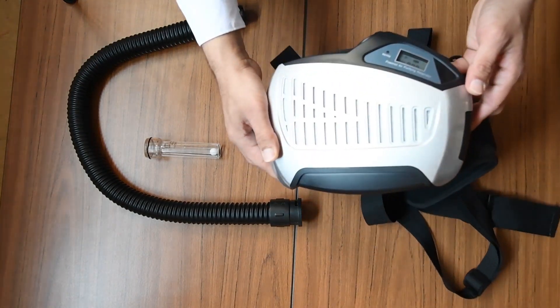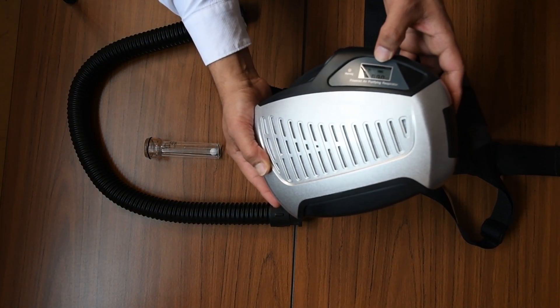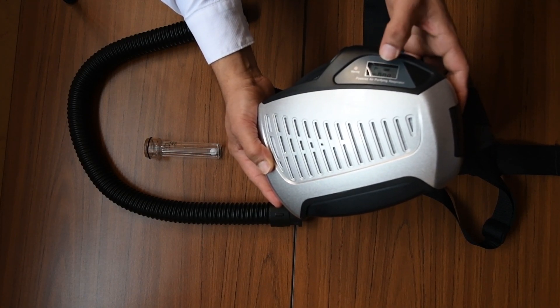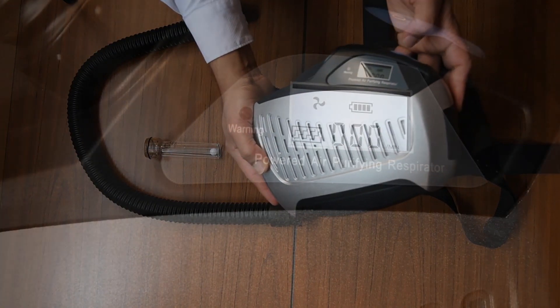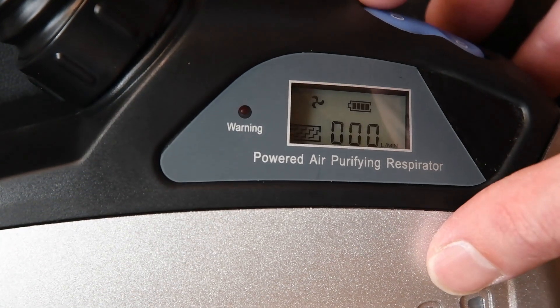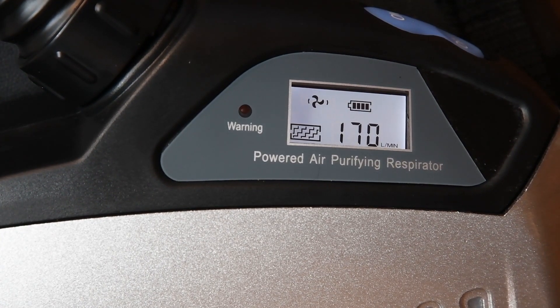When the power is on you can see a display. It shows a fully charged battery, a fan indicator, and the triple zero indicates there's no airflow. If there's any warning, one of the lights will start flashing. To turn the unit on, you just press the on button once — and you can see it's turning on.